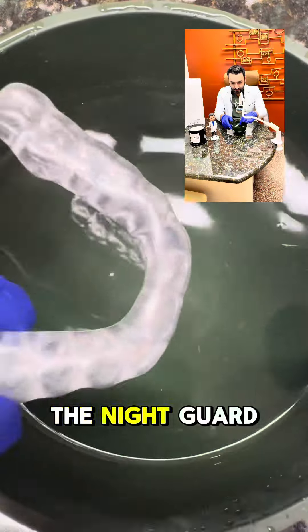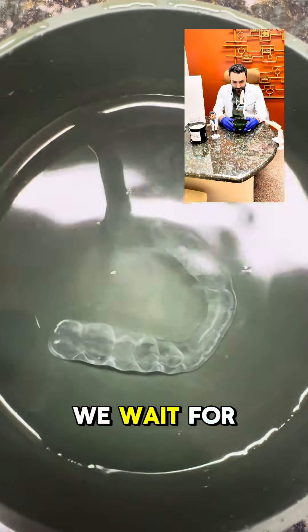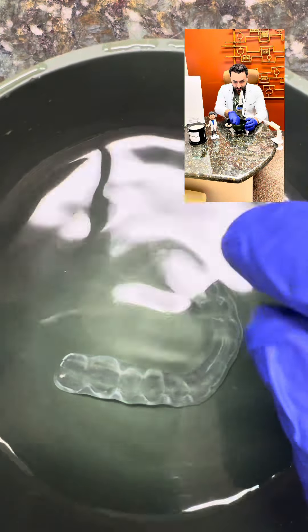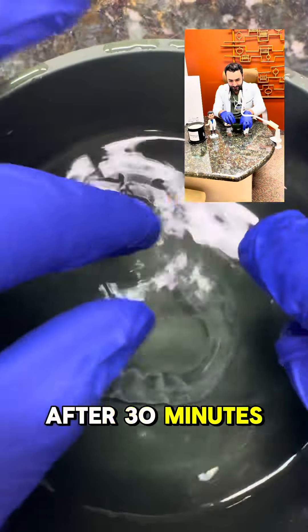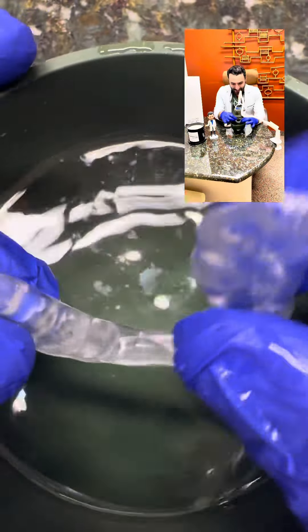We just put the night guard in the warm water and we wait for about 30 seconds. After 30 seconds, it becomes flexible.